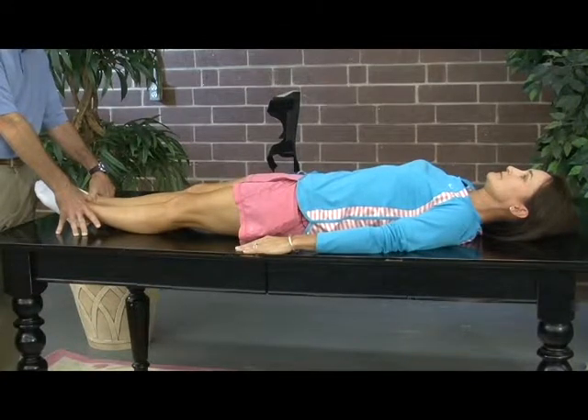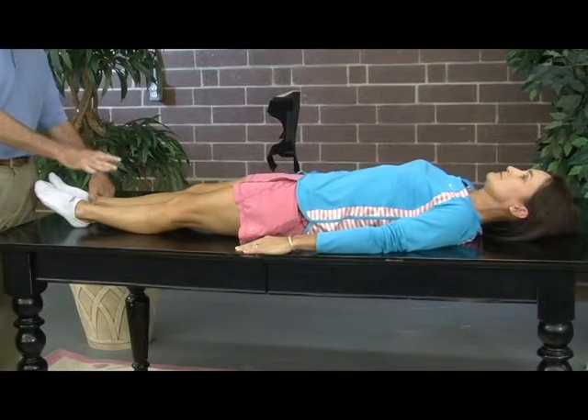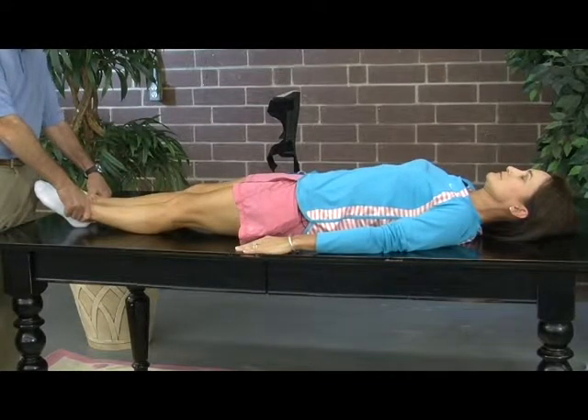So what did you take into consideration? Well, the first thing, we had to do a good evaluation. One, what was your medical condition? How weak was that foot? Did you have any push-off to start with? That's going to determine the amount of support and function you need from the brace. Secondly was your weight and size — is there anything about you that would require some unique changes to your support, not only the brace but other things we might try?